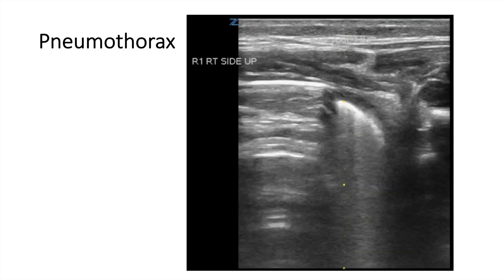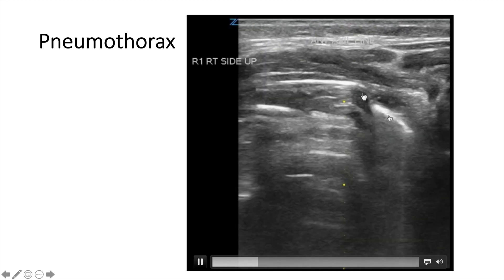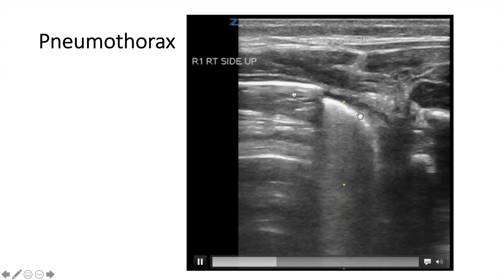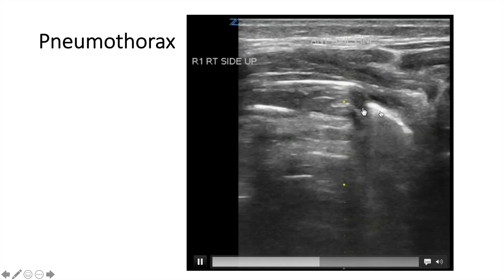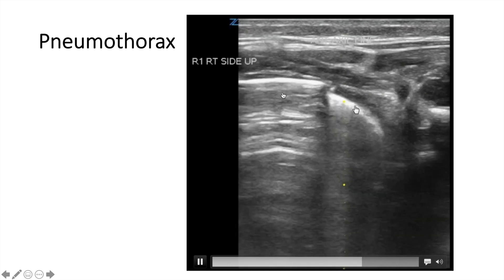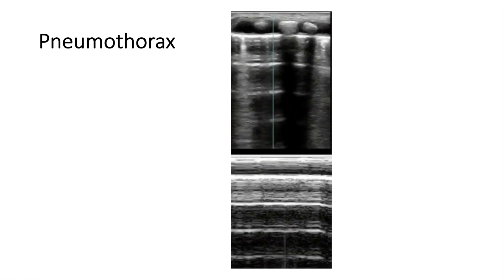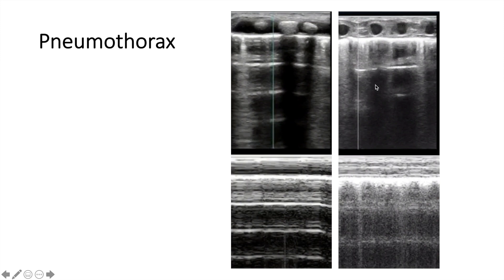In pneumothorax — as we talked about the pleura — this is a normal area here; you see the pleura sliding here, which is normal, versus this area where the pleura is not sliding. That's the pneumothorax versus the normal area, and you can direct the needle and drain the air directly there. You can also put M-mode if you suspect pneumothorax. You're going to see the barcode sign, which is a reflection of the absent pleural sliding, versus the normal granular or sand-like appearance on M-mode.